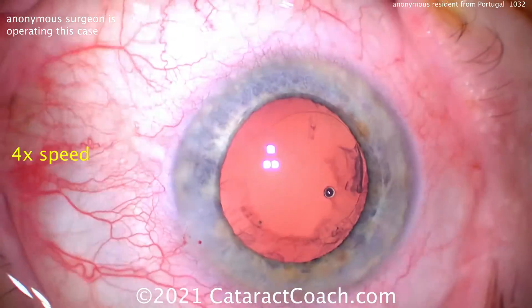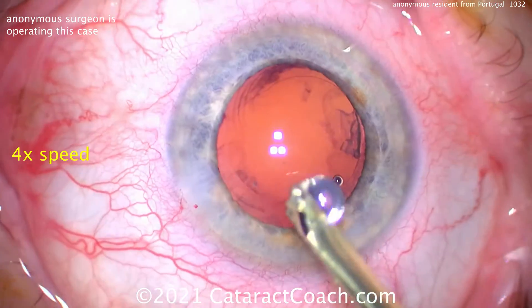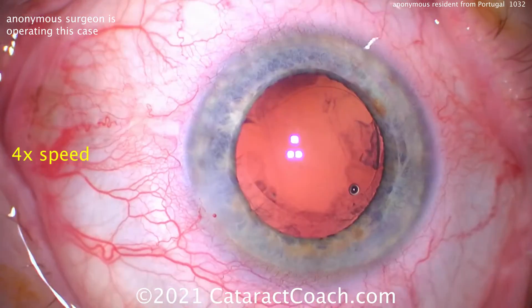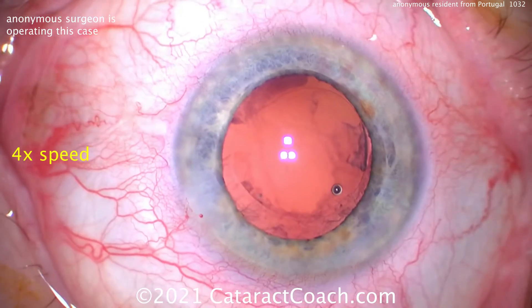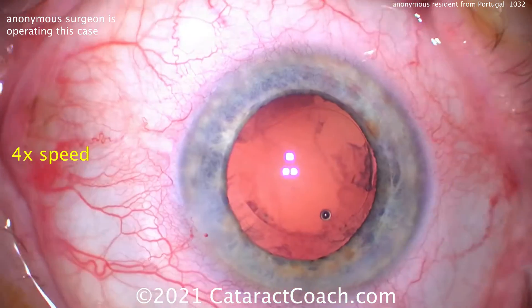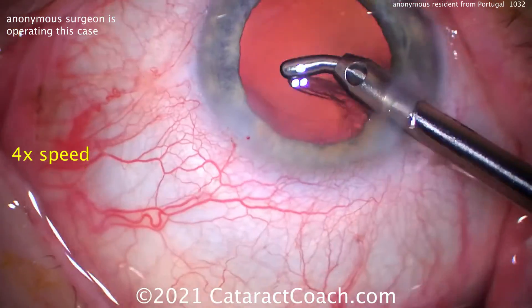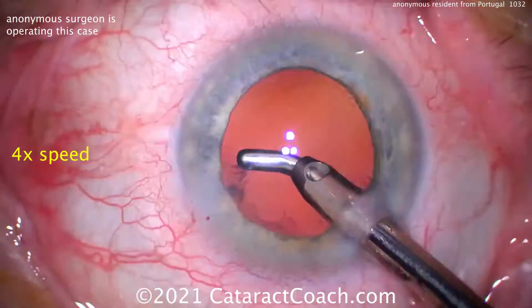Here comes the coaxial IA for cortex removal. Note that you may have to change the sleeve or adjust it yourself — don't rely on your scrub tech to do that. You can see that rhexis is not quite centered: it's a little bit closer to the pupil margin on the right-hand side of your screen and a little bit smaller than on the left. There's not a lot of cortex because the hydrodissection was good. Cleaning up that sub-incision layer, of course, is the tricky part.